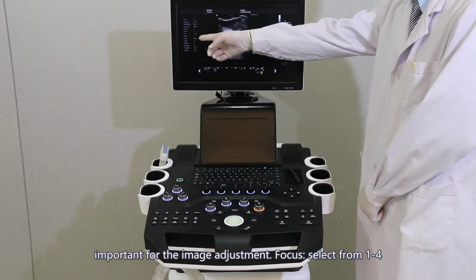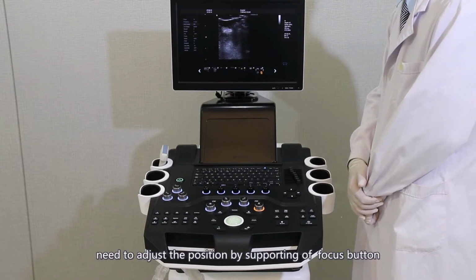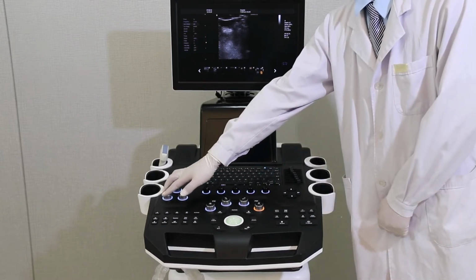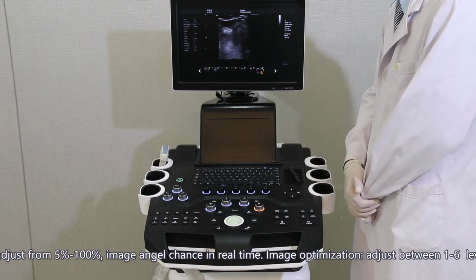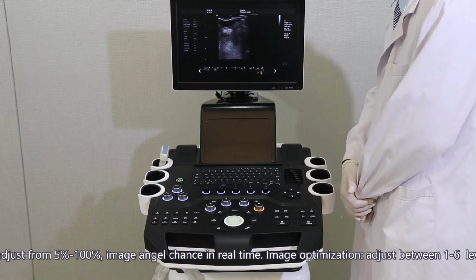Focus. Select from 1 to 4. You need to adjust the position with the support of the focus button. Scanning range. Adjust between 5% to 100%. The image angle changes in real time.